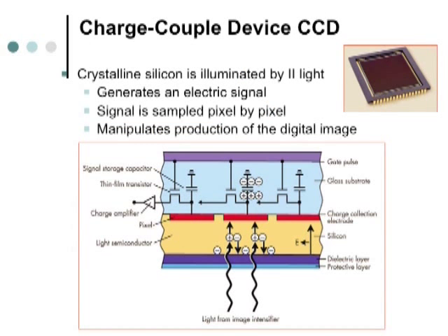So basically, here's the light coming from your output phosphor, which is on the image intensifier. It goes through the silicon and is converted to electrons, kind of like your latent image. Those electrons go to the thin film transistors, which create the current, kind of like a capacitor, and then that is sent to the computer to give you your image.